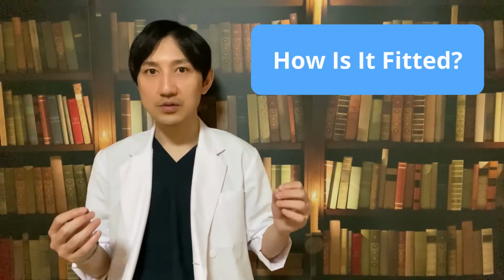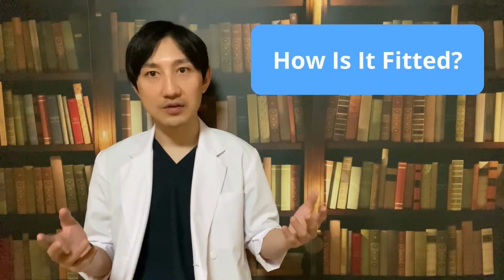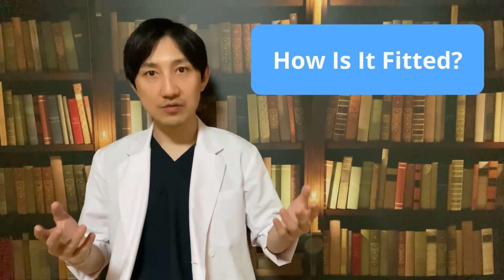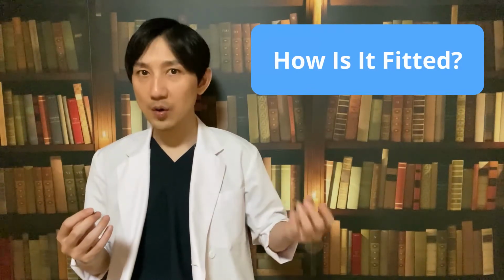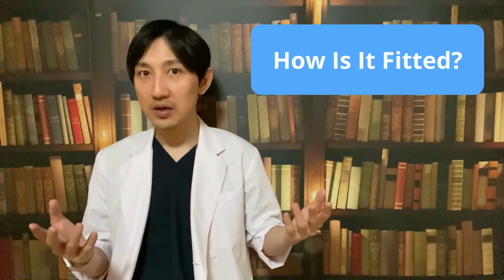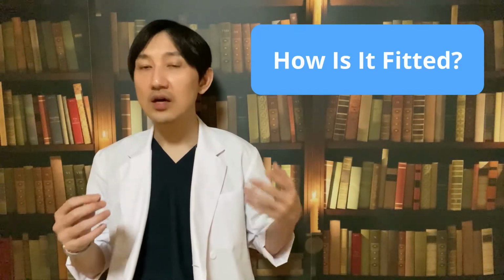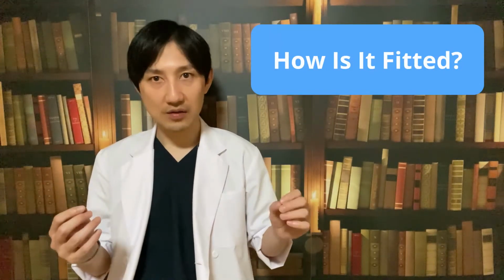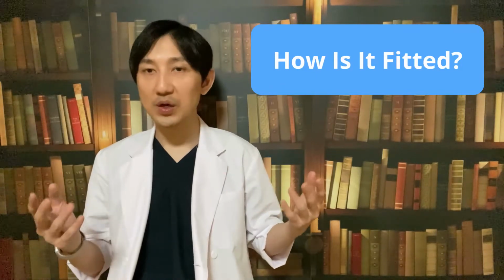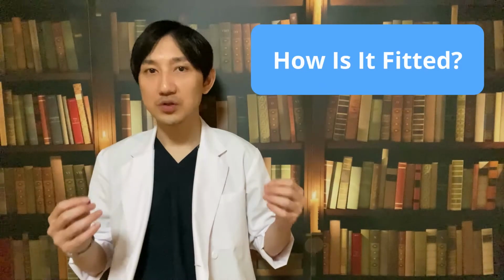The doctor holds your vagina open like when you are having a smear test and inserts the IUD up through the cervix. This can be done at any time of your menstrual cycle. It can be a bit uncomfortable, but you can discuss having a local anesthetic with your doctor. After the IUD is inside you, you have immediate protection against pregnancy. You may experience some cramps, like during your period, and a little bleeding in the next few days, but over-the-counter painkillers usually deal with this.